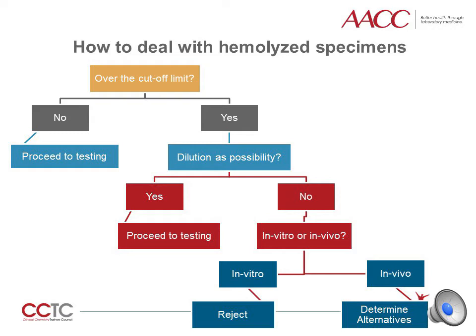In instances of in vitro hemolysis, the specimen should be rejected and the clinical staff ought to be notified to recollect the sample properly. In instances of in vivo hemolysis, the clinical staff ought to be notified and the underlying pathology should be addressed first. As a lab professional, you can also recommend alternative testing. For example, you can recommend measurement of ALT as opposed to AST to help evaluate liver function.